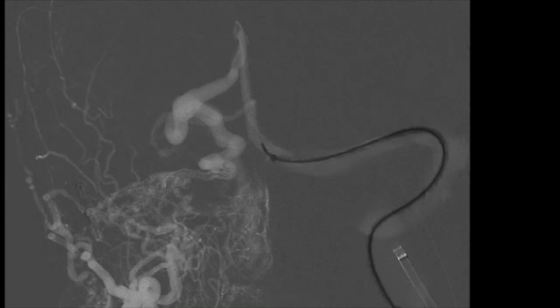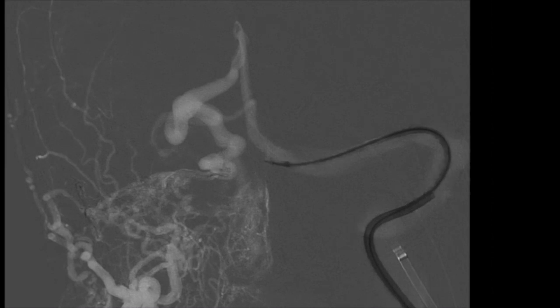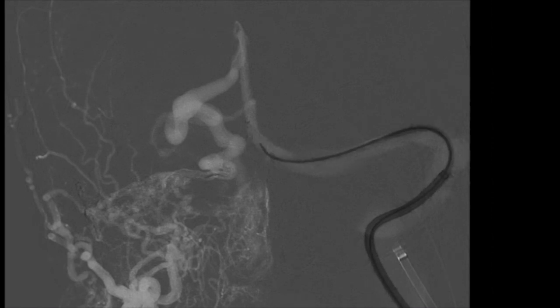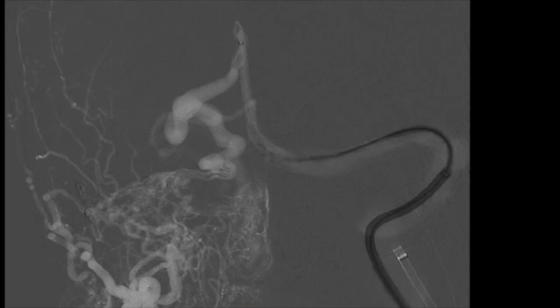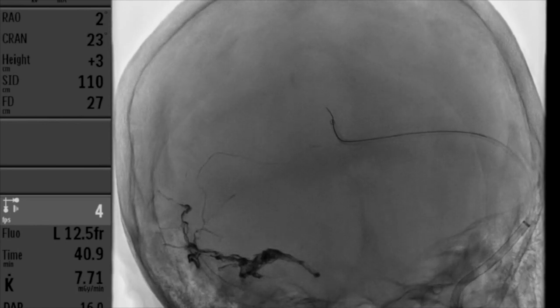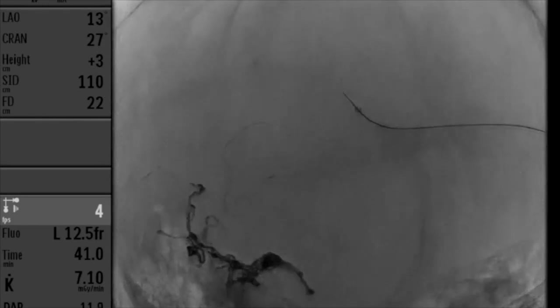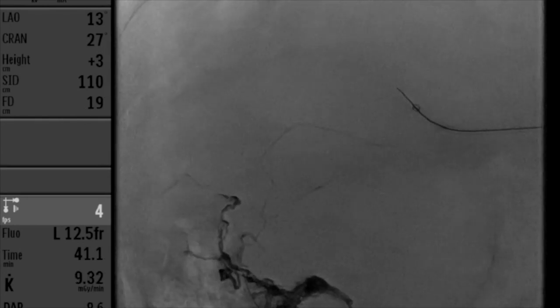Here we are advancing the large guide catheter for more support to the intermediate catheter. Eventually we are able to pass the intermediate catheter to the origin of the straight sinus. We then rotate the fluoroscopy view to open the angle from the straight sinus into the deep venous structures — in this case the vein of Rosenthal.